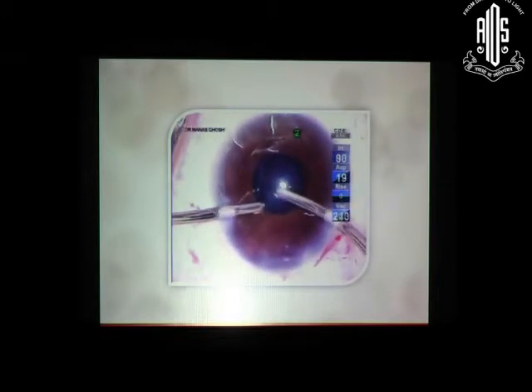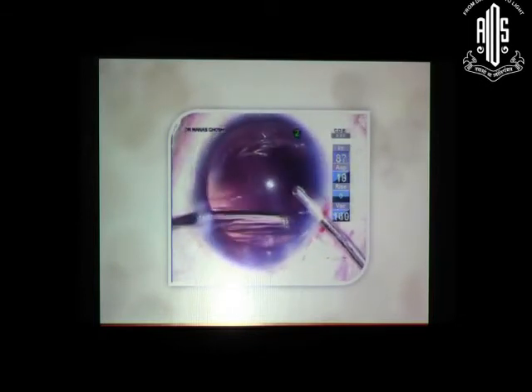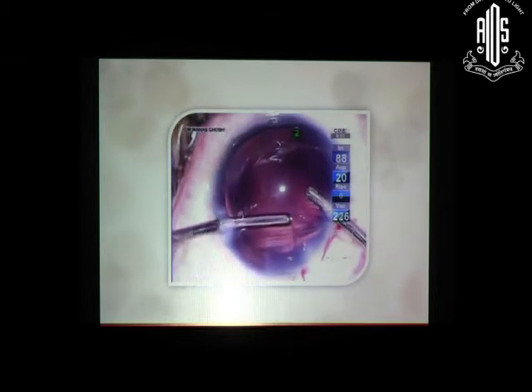And so, before taking out the phaco probe, I am injecting viscoelastic inside so that the chamber remains deep. Then I am using bimanual irrigation aspiration. Now see, once I introduce my irrigation cannula, there is dilation of the pupil and deepening of the anterior chamber. You frequently encounter this, sometimes you get frightened with this.